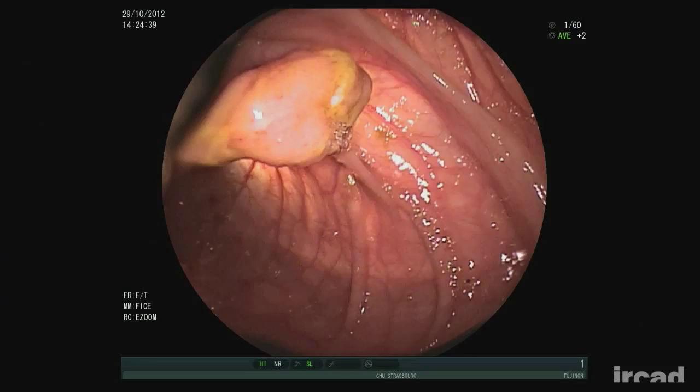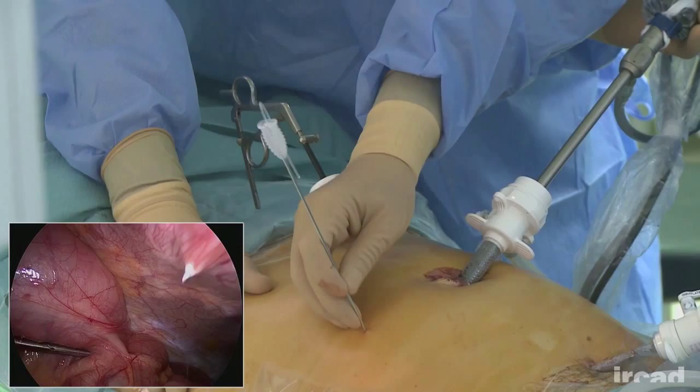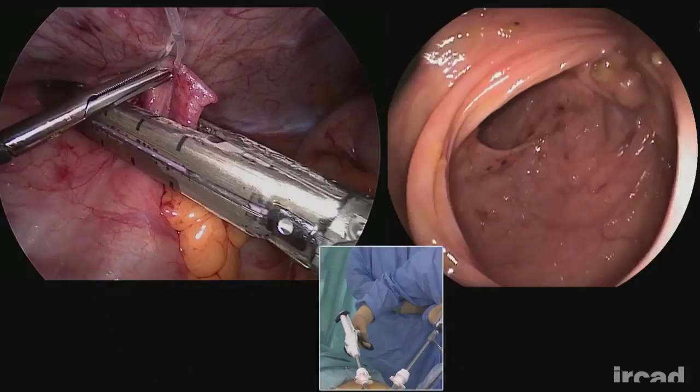The exact location of a suspicious polyp is identified by intraoperative colonoscopy. Two T-Lift devices are then positioned above and under the polyp to clearly delineate its position. The devices are pulled up and the colonic wall containing the polyp is resected by means of a linear stapler. The wall segment is extracted through an endoscopic bag, and the specimen containing the T-Lift device and the polyp is displayed.